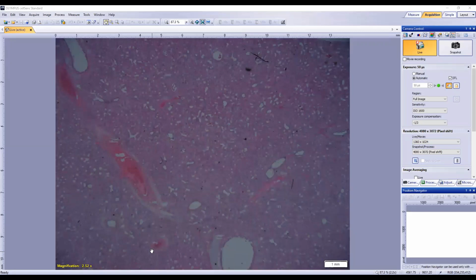Let's go about describing our way through some of this while we're still at this power. People have mentioned already, this is looking like an interstitial or a bronchointerstitial pneumonia. What specific features are you going to be looking for if this were an interstitial pneumonia, using specific descriptive terms? Thickening of the septa. Yep, thickening of the septa. And Anna said exudates and inflammatory infiltrates as well.